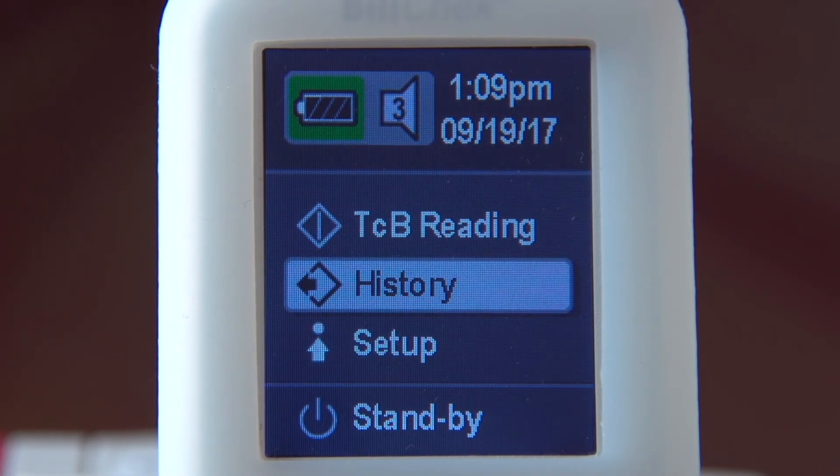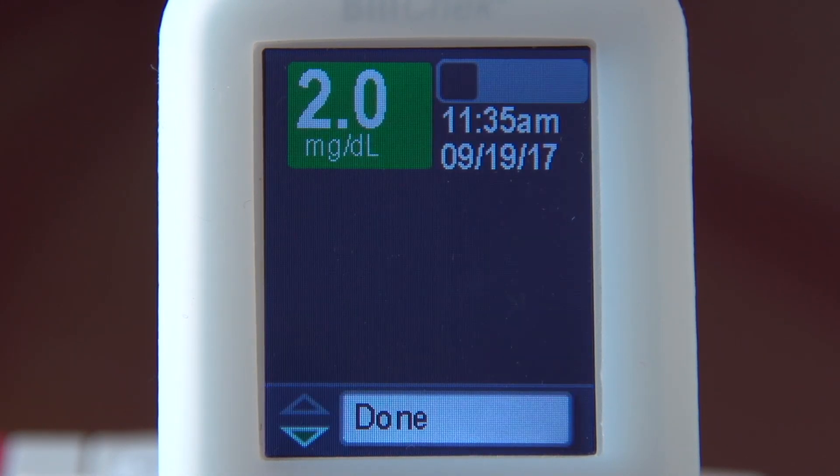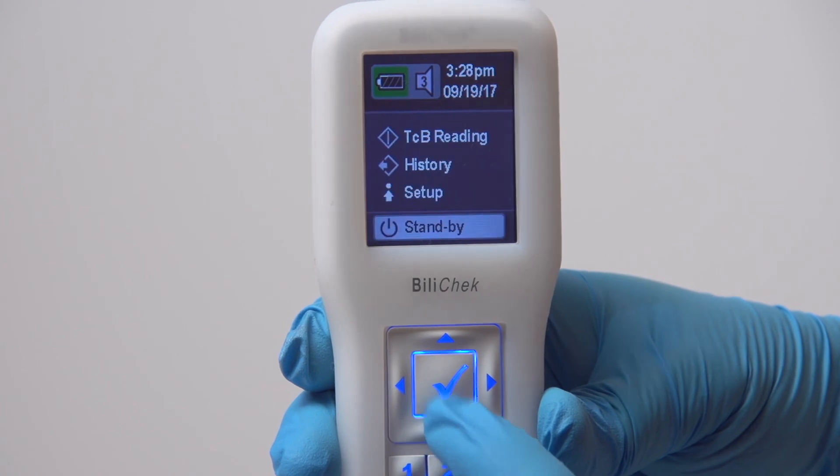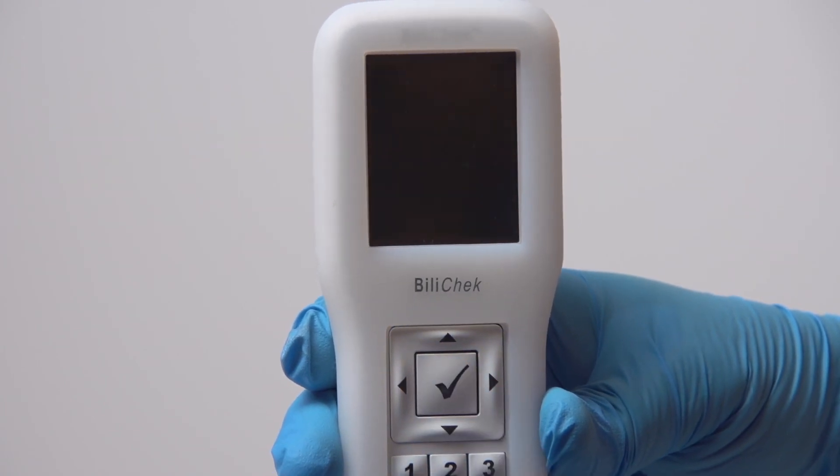Select History to access patient data that is stored in the handheld unit. The unit stores up to 30 records. Once the record limit is reached, the oldest record is deleted. Select Stand By from the Home screen to turn the screen off between readings.